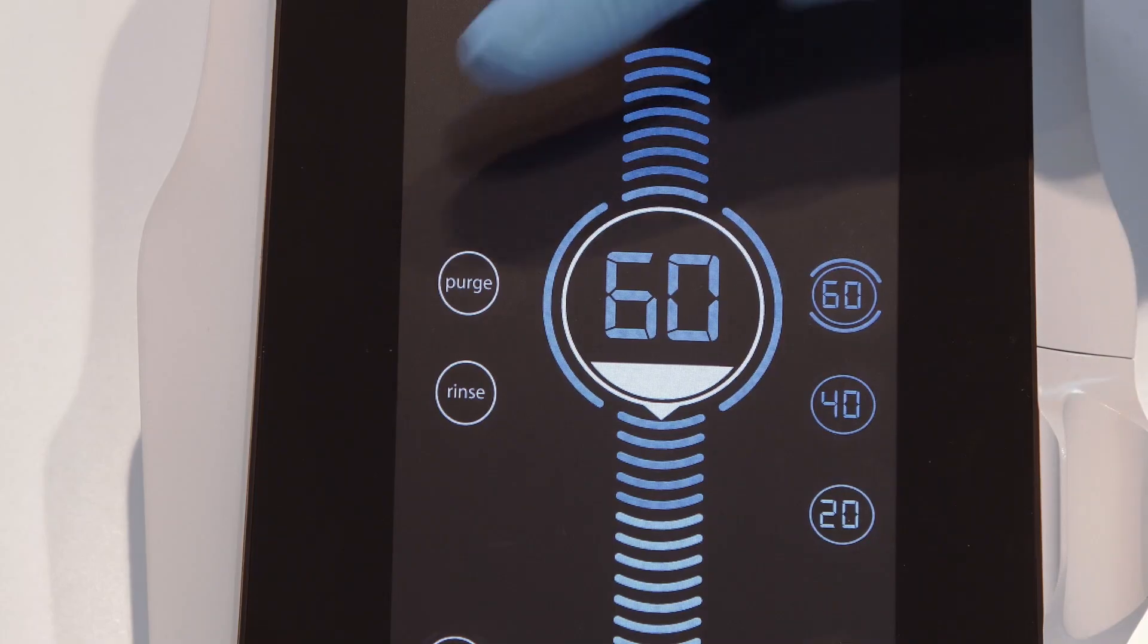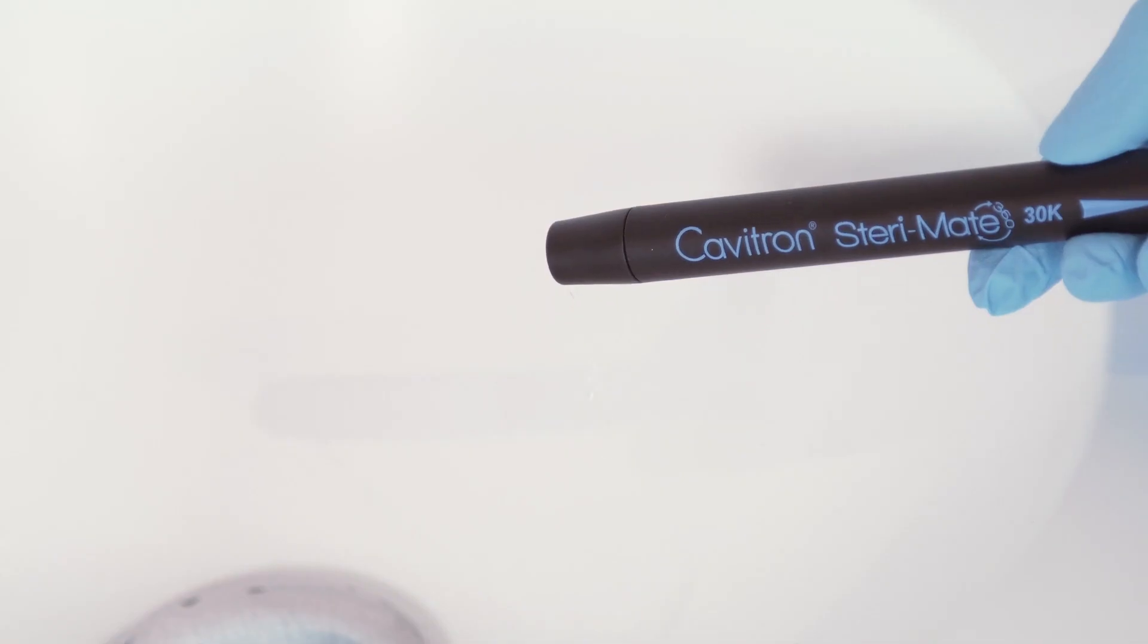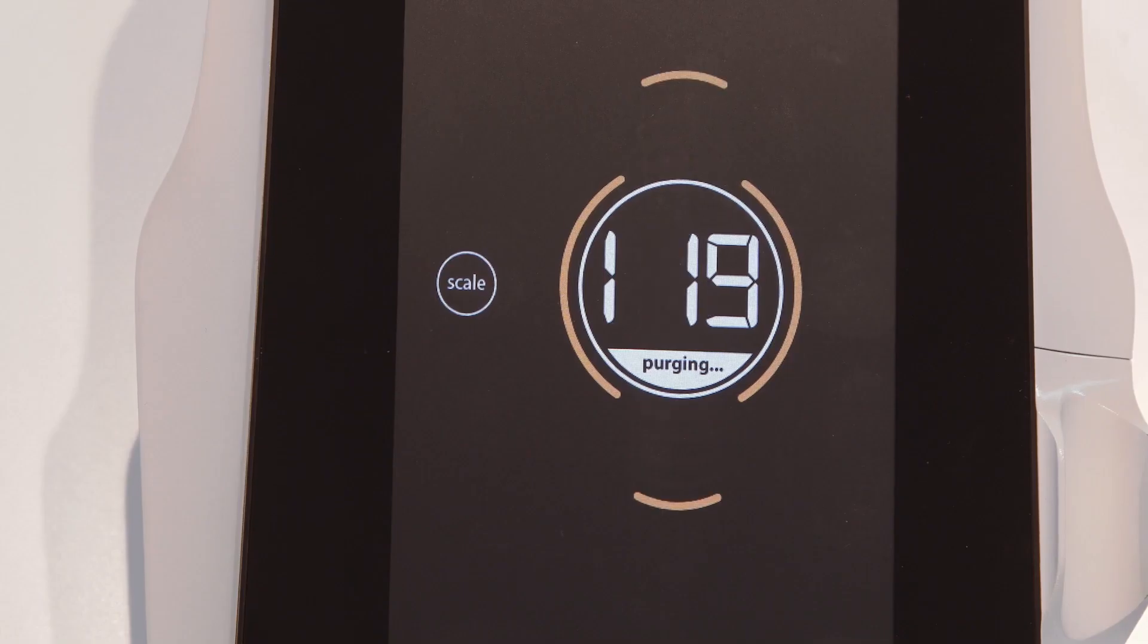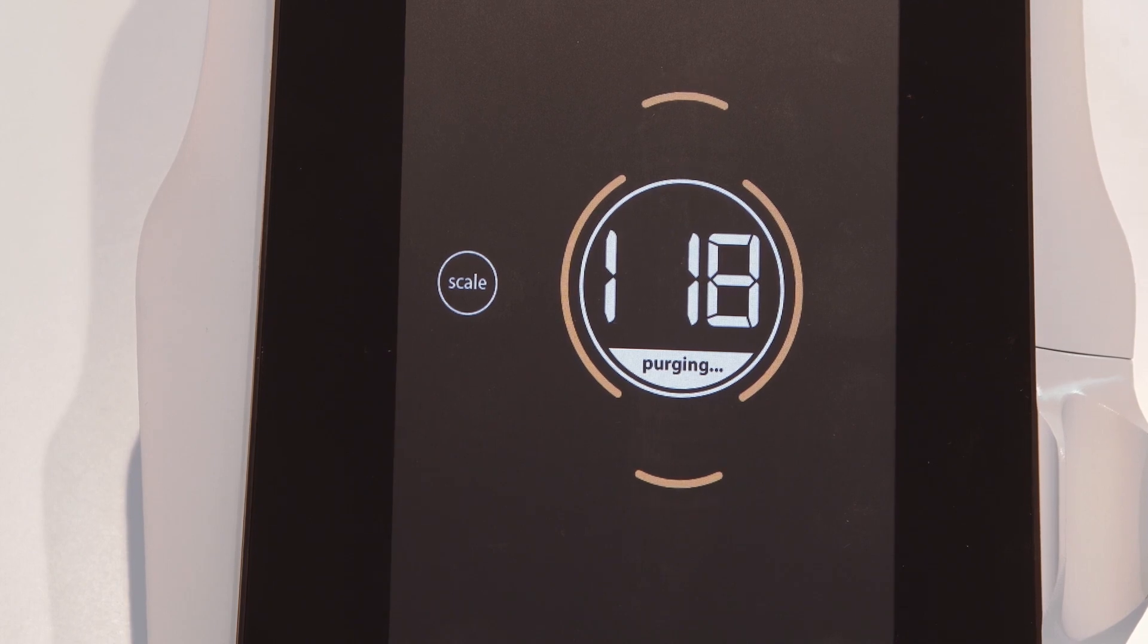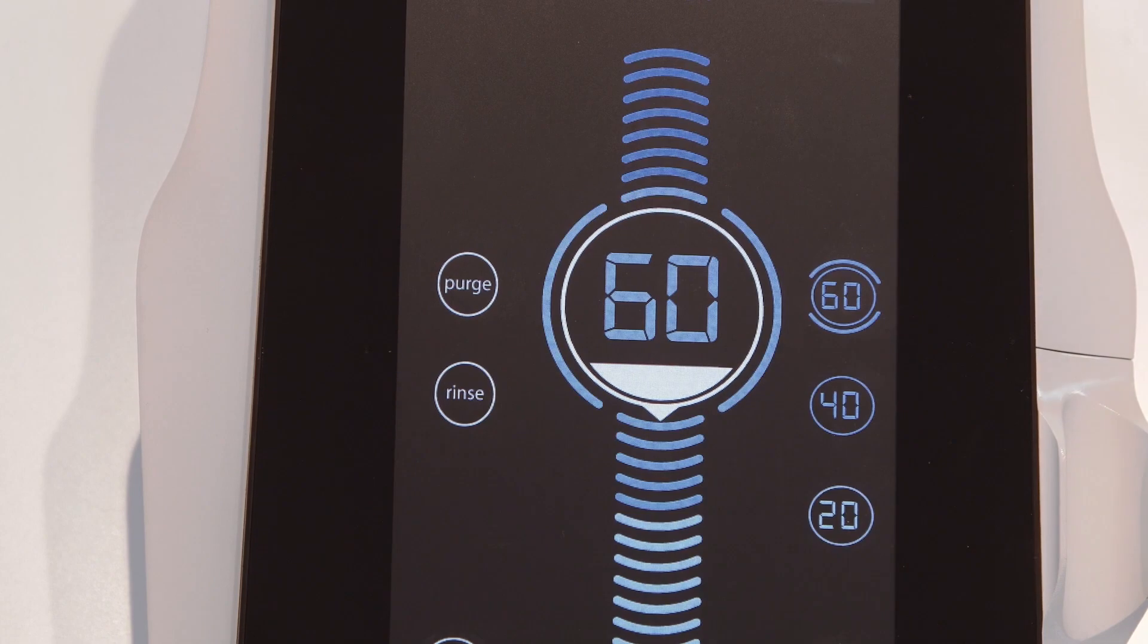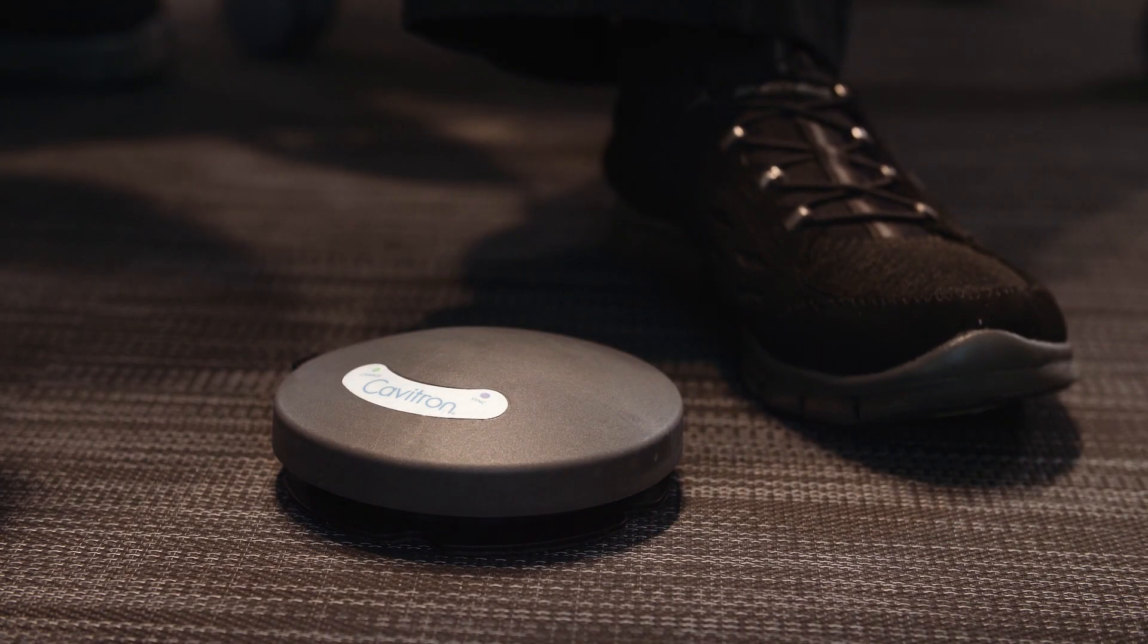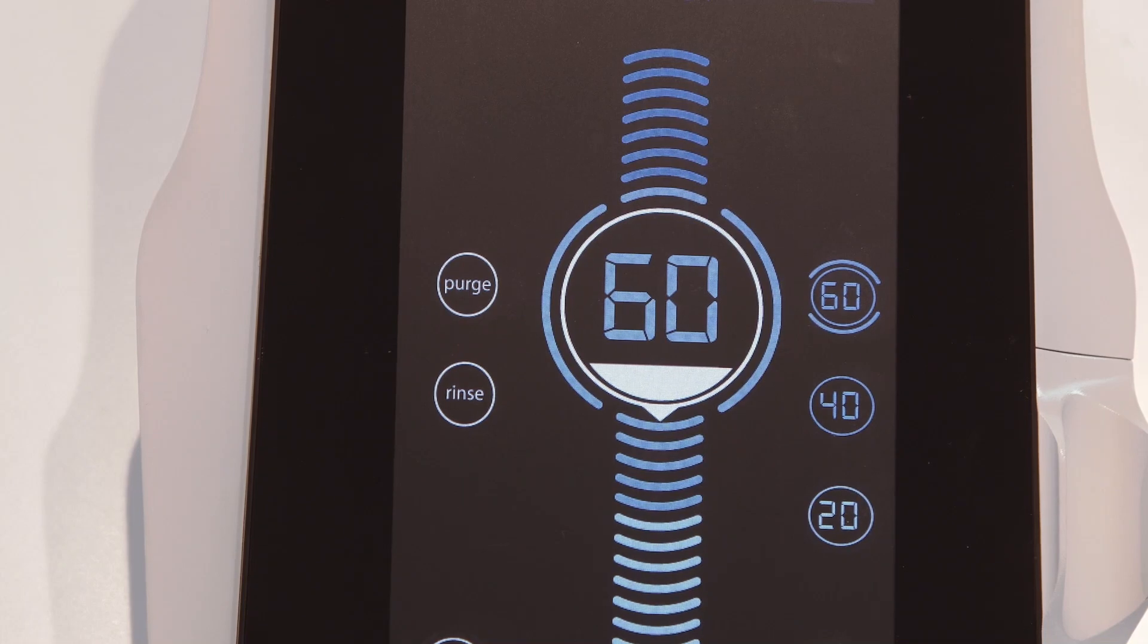This setting is used to flush the water lines at the beginning of the day or between patients. Purge will run automatically for two minutes, and adjustments can be made for maximum water flow with a countdown in seconds shown on the screen. Press the scale button to return to the main screen, or simply tap the foot pedal. After a two-minute countdown, it will then return to the main screen.